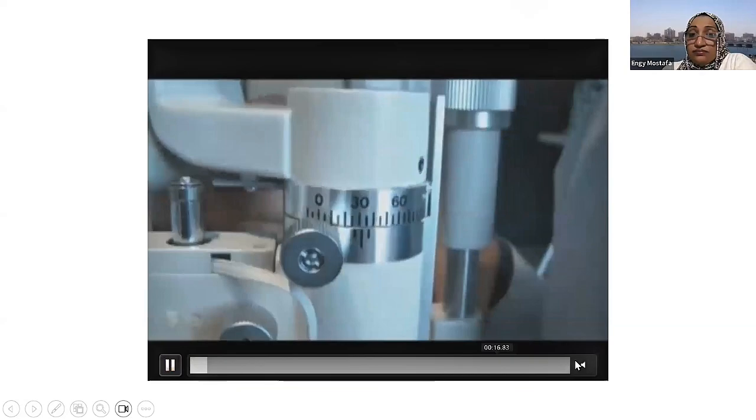They use it in conjunctival staining as well. It's very good in conjunctival staining in cases of dry eye. This is the advantage of rose bengal. Otherwise, as we do not find it in our locality, we can go with the fluorescein dye.